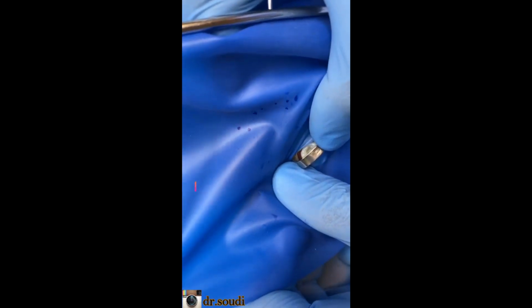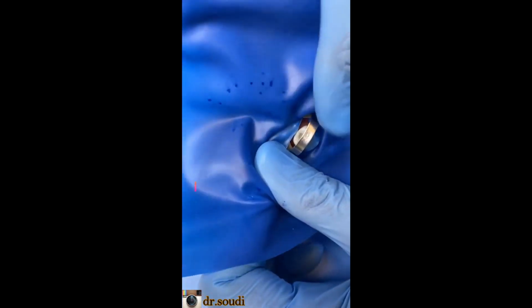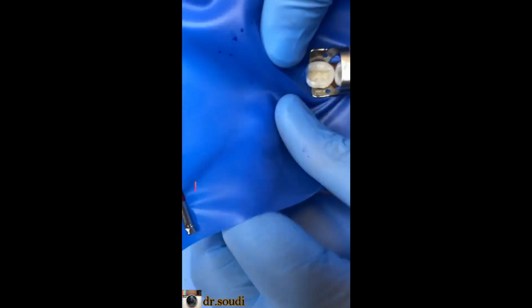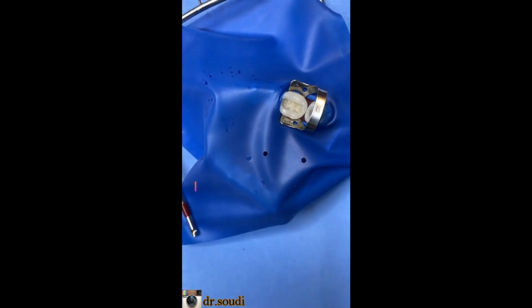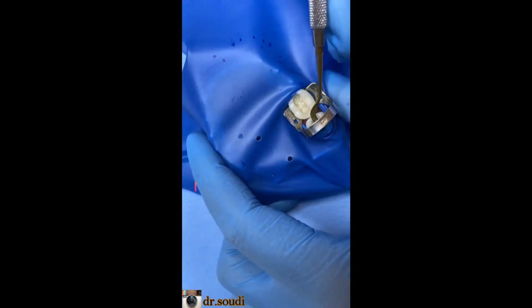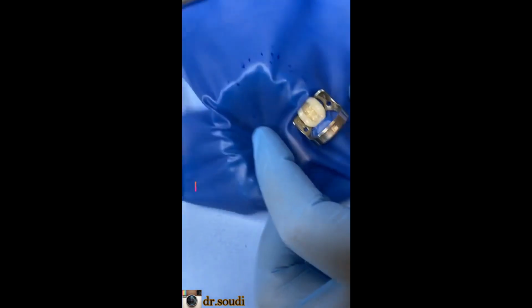Pass the bow first, okay? Not the arms. The bow first, okay? Like this. You have the isolation. But look here, it's not completely isolated. So you should bring your sheet to be like this.